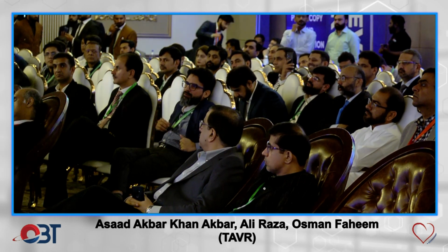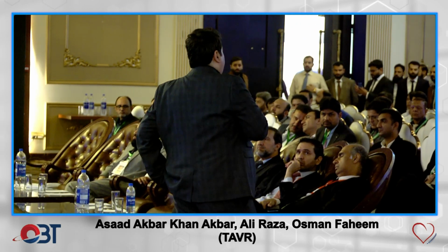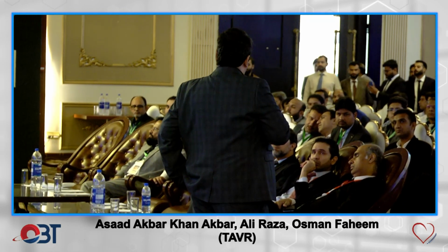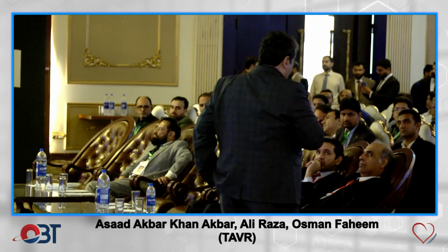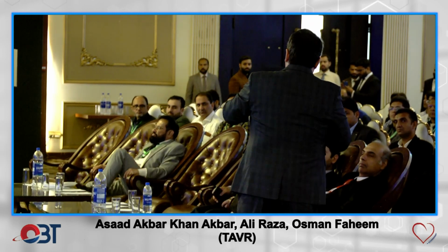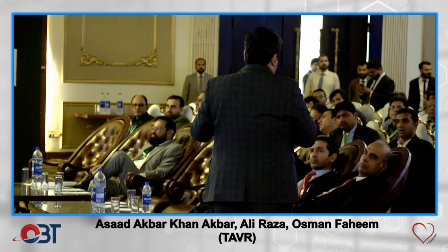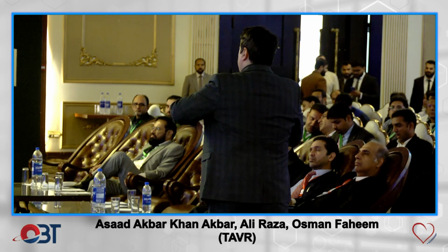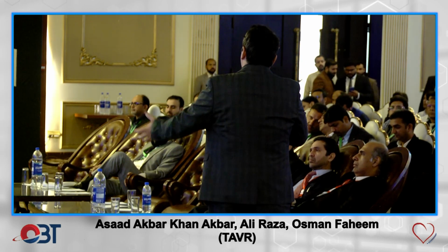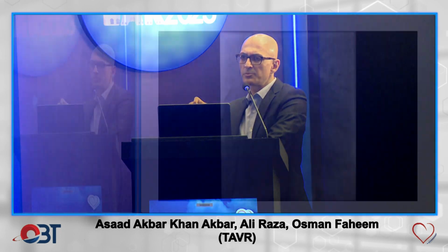Yeah, I learned that when I went to UK to do that, actually, that was in Canada when I was doing it. He said, if it pops out, everything will pop out with you. So they were a bit hairy about doing that. But yes, you're very right that you have to release the tension from it. And I think this is the phase where you have to give them as much time as you can and let the torque get out of the system, so then it will move less. So I do pull the wire back, but not aggressively. And then we do a very slow deployment.